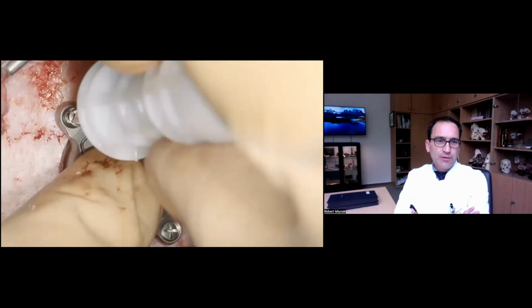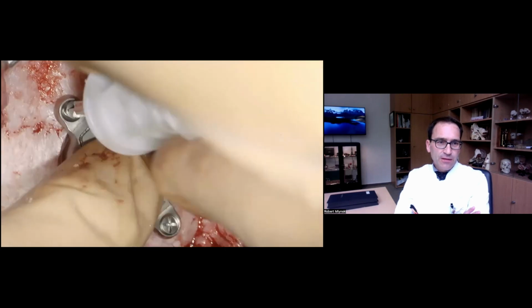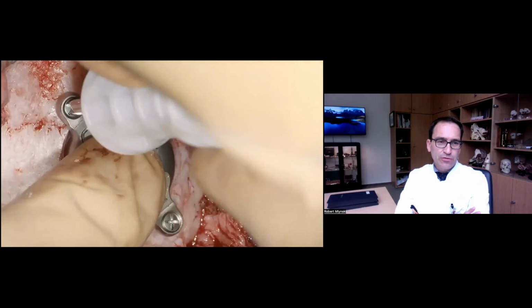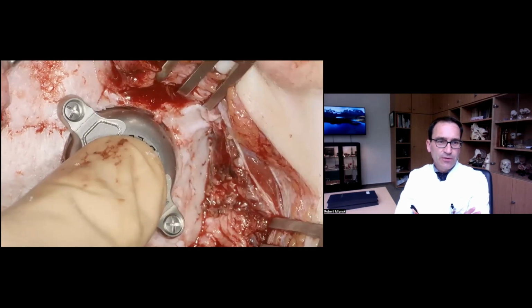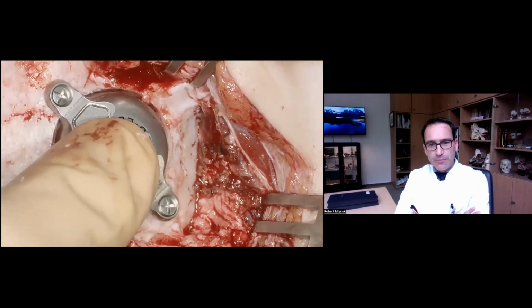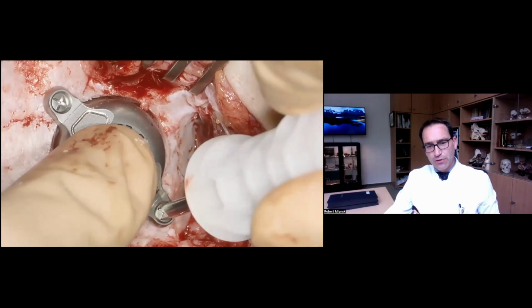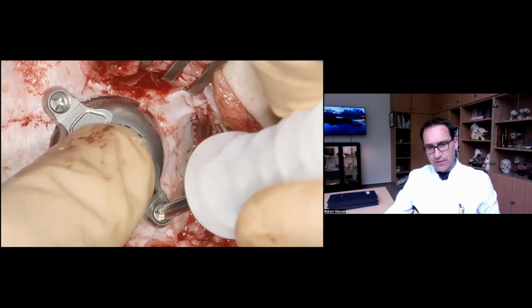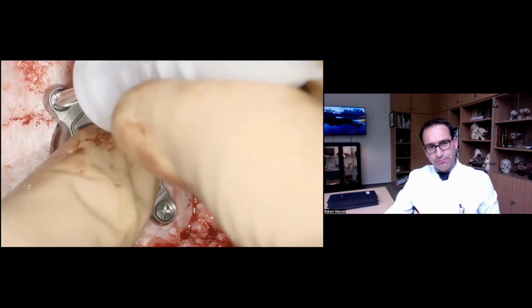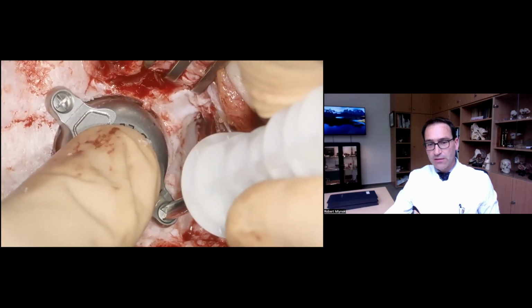So with the screwdriver, we fix the implant. Always remember not to overturn the screws. It should be hand-tight. Both screws should be in place, and then one screw after another is tightly screwed in at the end. So that's basically it.